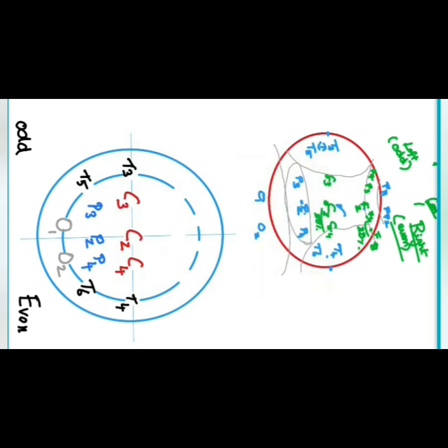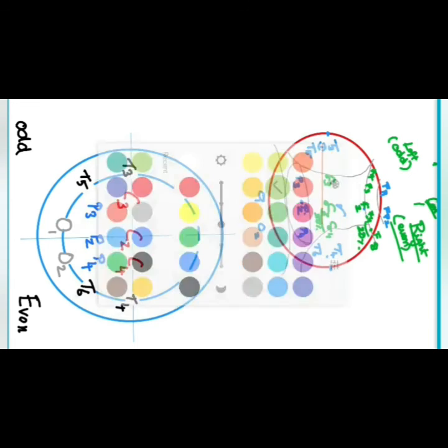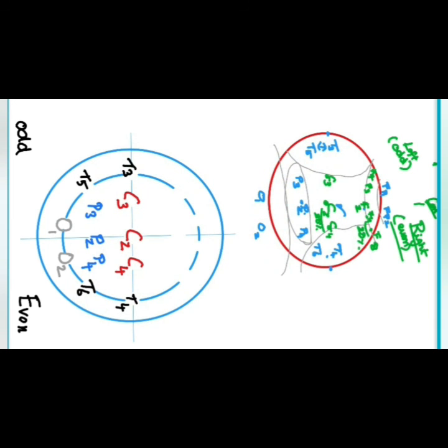Then we'll have the frontal region, which is the long region, so next will be F4 and then F8. On the left, F3 and F7. Then on the top we have frontal polar 1, frontal polar 2, right?